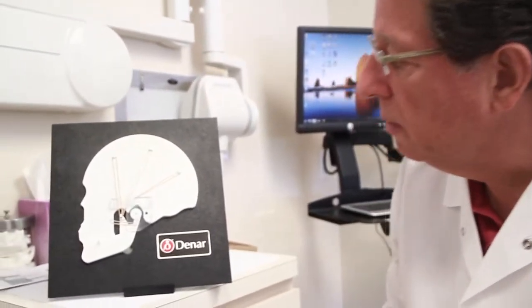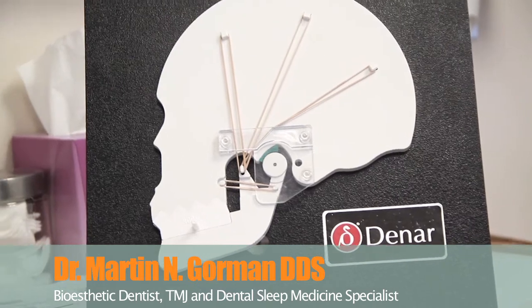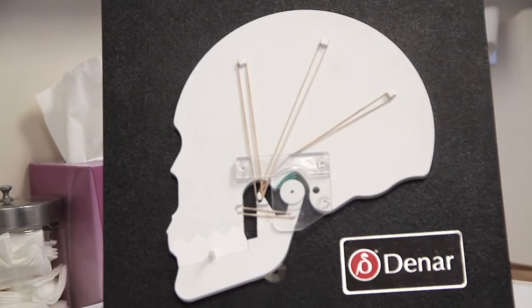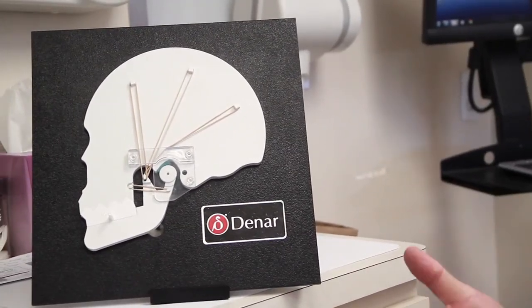This is going to be a little video on the Denar TMJ model and how this works. I show this to every single TMJ patient that comes to my practice, or any patient that has bite issues.